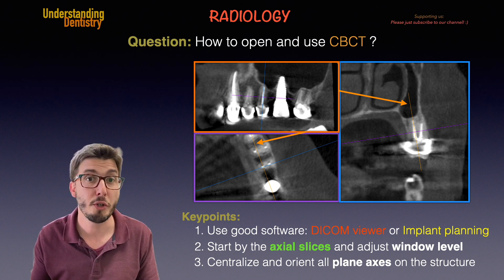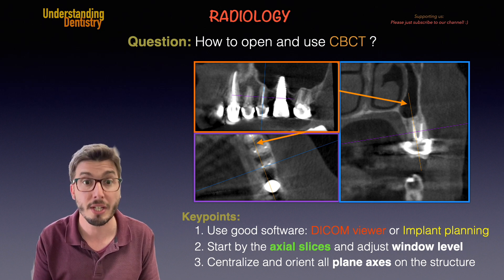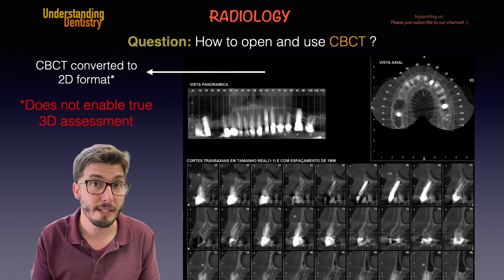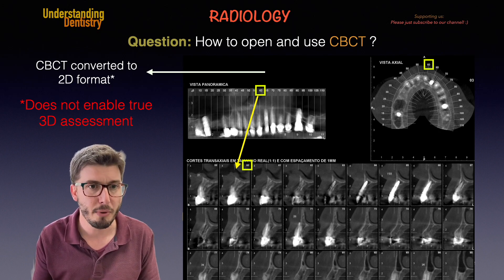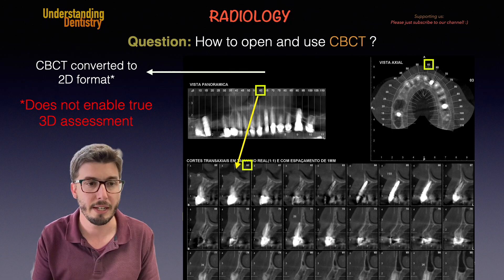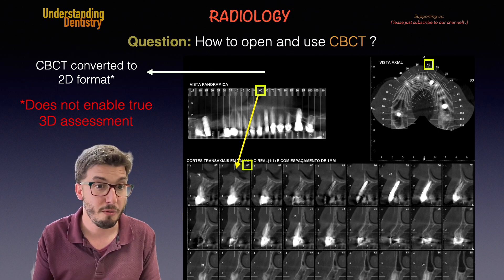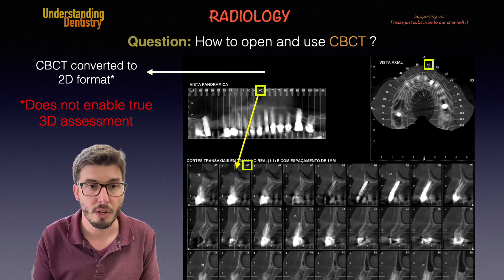Several dentists still prefer to assess everything on 2D files, like JPG images. If you don't want to use your software to navigate through the images, you will probably receive a CBCT converted to the 2D format. We need to understand the numbers on the row — for example, number 60 is a cross-sectional slice of the left upper central incisor. All you need to do is find cross-sectional slice number 60 and evaluate the buccal-lingual dimensions of that area.